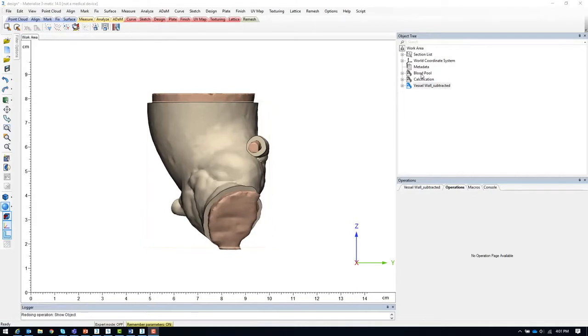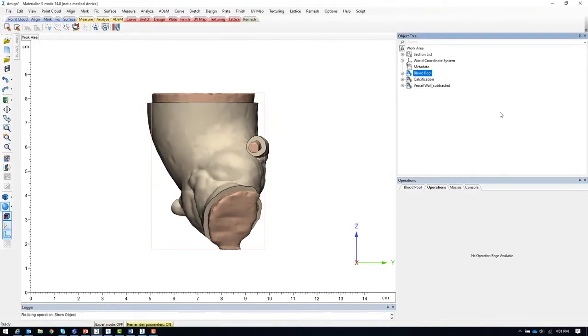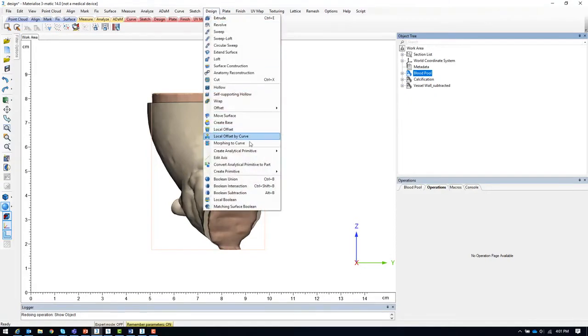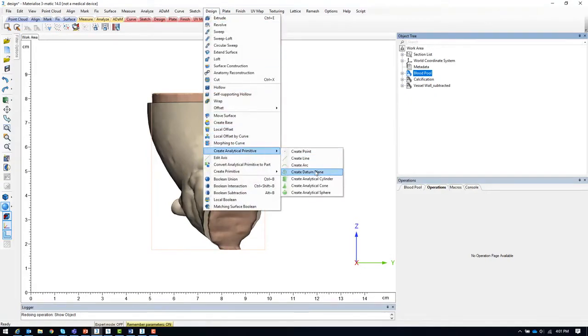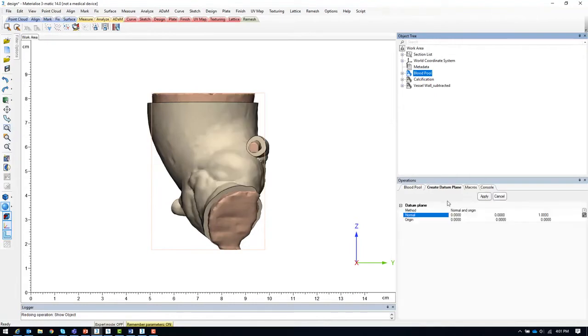To create the internal cavity model, we will trim the blood pool model so that it is one millimeter inside the vessel wall model. To perform these cuts, we first need to define datum planes at the vessel openings.